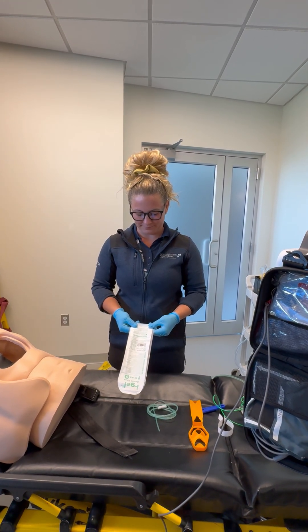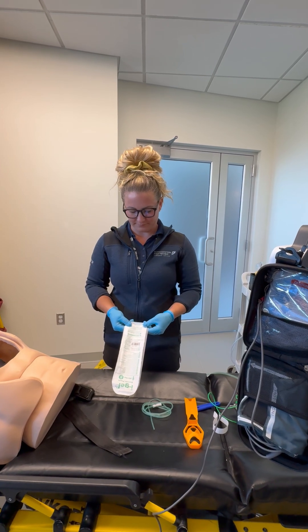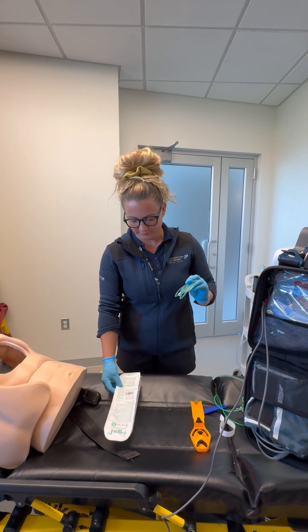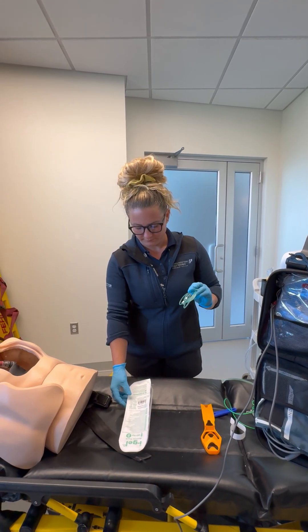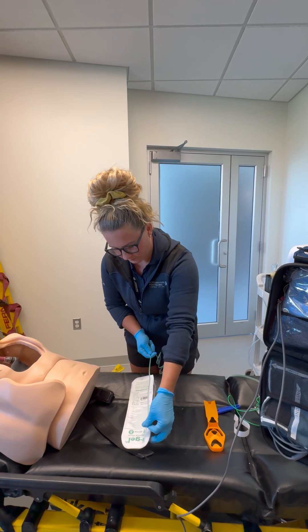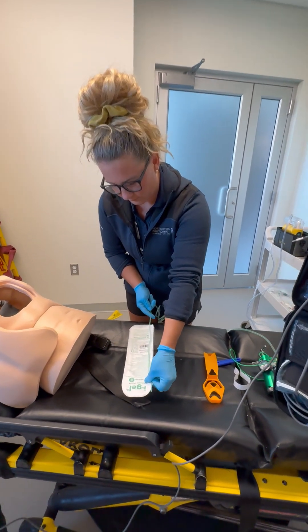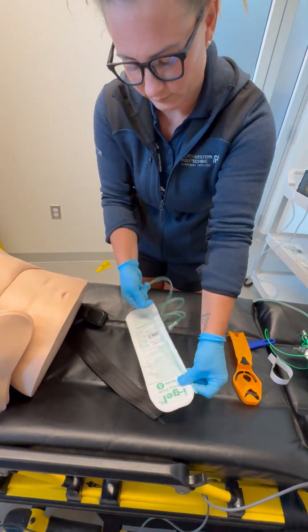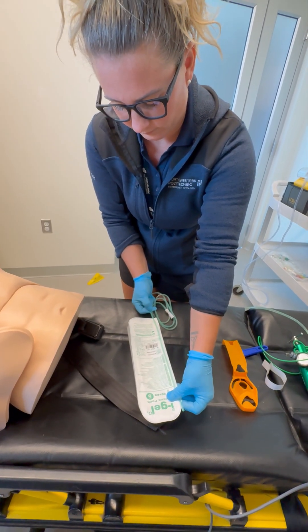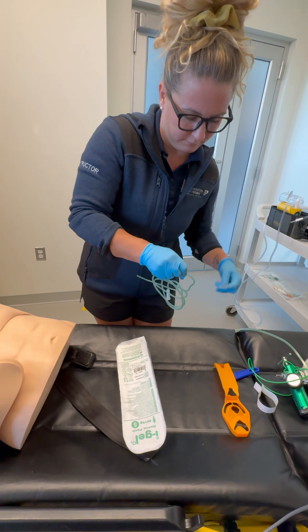You will open the suction catheter included in the package. You'll use the flat label side of the i-gel measuring guide, straighten the suction catheter, and measure along the length of the package to the distal tip of the suction catheter. You will add two centimeters to this length and apply tape around the suction catheter to mark the depth.